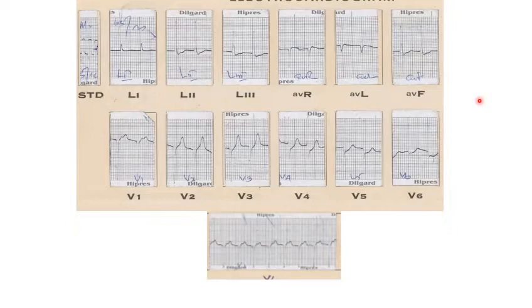It seems that this is an AVRT. Very good. Yes. Sir, in atypical AVNRT, we will get the P wave following the QRS complex. We will be able to see P waves in atypical AVNRT, sir. Yes, yes. What is it? I didn't go to that. What is atypical AVNRT? Sir, the P waves will be seen. P waves of the preceding QRS will be seen in front of the next QRS. Like this. No, it is outside the QRS.